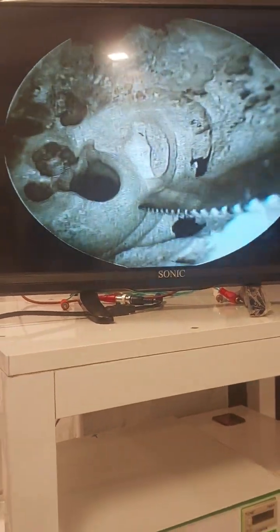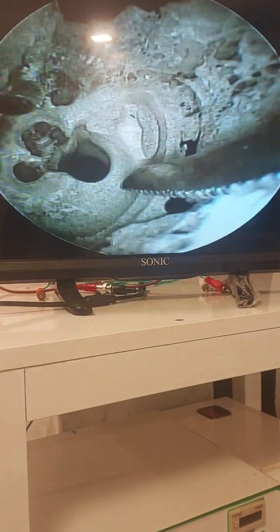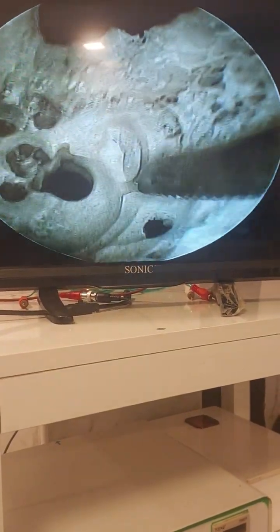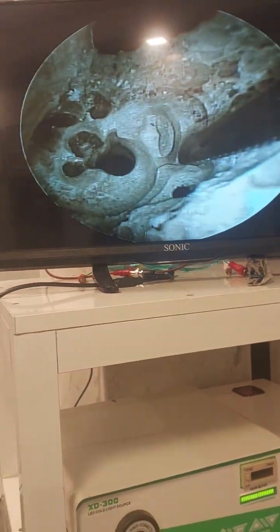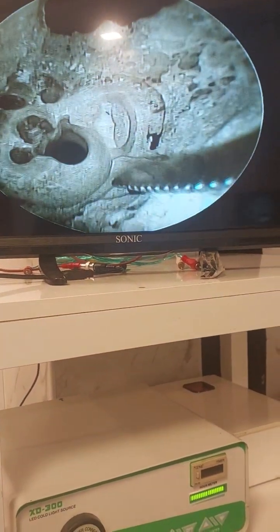and it opens to the utricle. This is the utricle of the vestibule, the utricle posteriorly and the saccule anteriorly. The superior semicircular canal is ampullated, then the common crus, then the posterior semicircular canal. This is the ampullated end of the posterior semicircular canal.